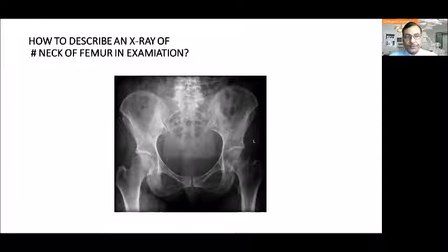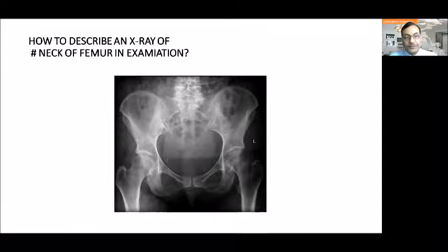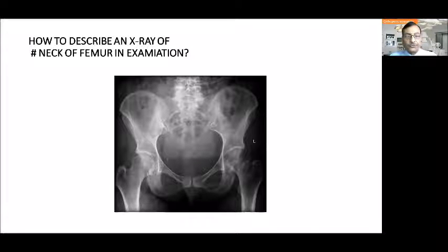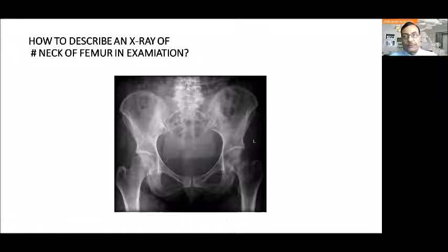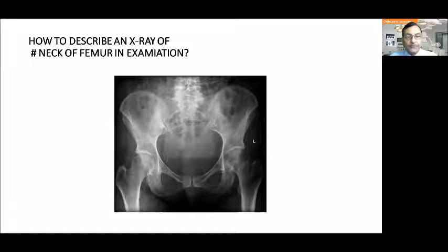This is a very important topic for examination purposes as well as in hospital practices when a doctor or student has to see the X-rays of a fracture neck of the femur. So how do we describe an X-ray of fracture neck of the femur if asked in an examination?